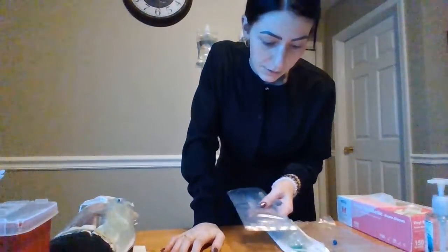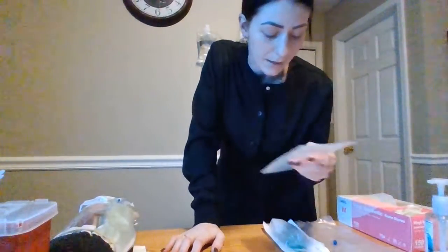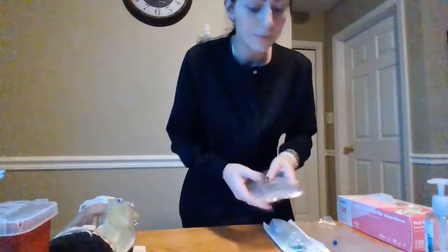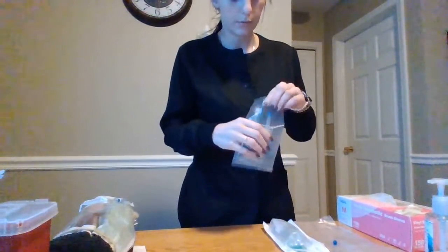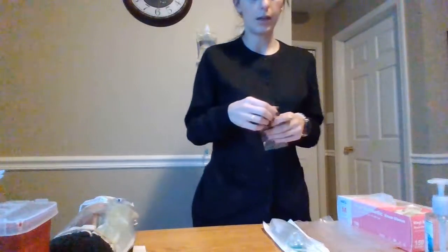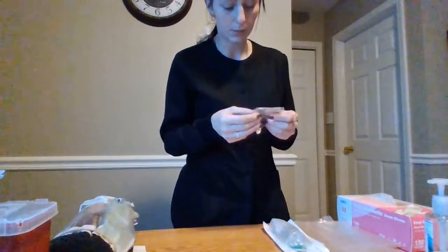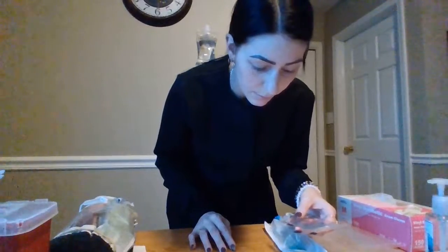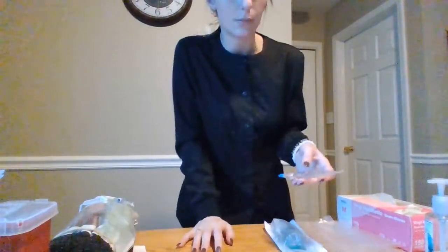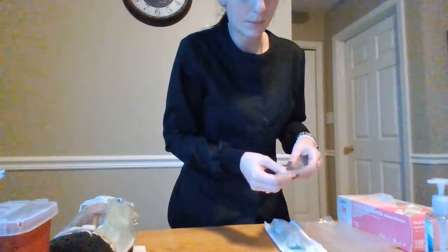So we have on the medication administration record, ciprofloxacin 200 milligrams per 50 milliliters of 0.9% sodium chloride, and I have ciprofloxacin 200 milligrams and 50 milliliters of 0.9% sodium chloride. So that matches up. I am going to remove the outer bag and use aseptic technique. I will check again for integrity of the bag. No issues with that. The expiration date is January 2023, and we are looking again. We have ciprofloxacin 200 milligrams and 50 milliliters of 0.9% sodium chloride. And the bag is ciprofloxacin 200 milligrams and 50 milliliters of 0.9% sodium chloride. We're giving this intravenously through the intravenous piggyback.